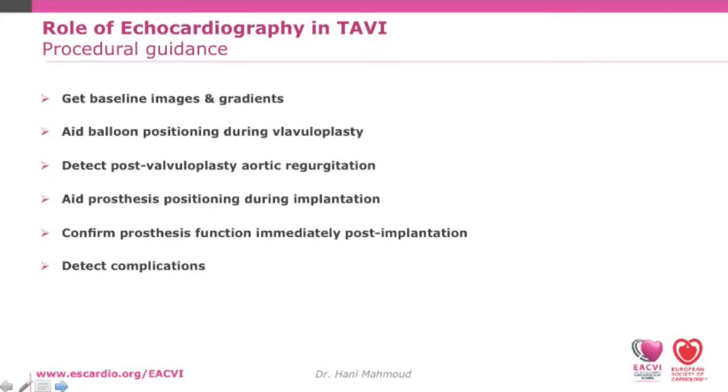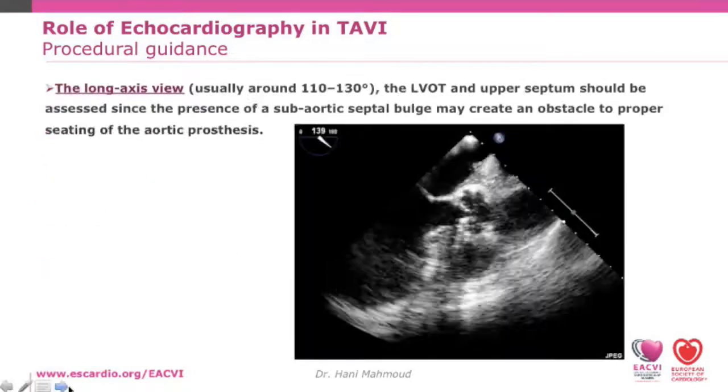Procedural guidance. It can aid in baseline images and gradients, aid balloon positioning during valvuloplasty, detect post-valvuloplasty aortic regurgitation, aid prosthesis positioning during implantation, confirm prosthesis function immediately post-implantation, and detect complications.